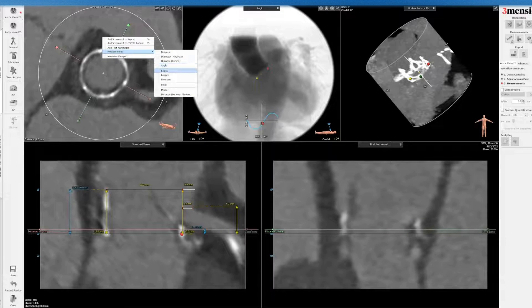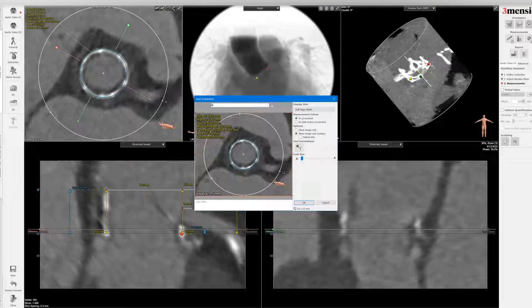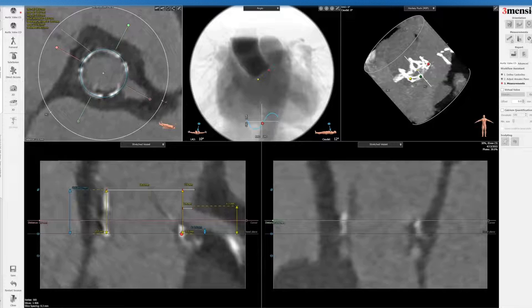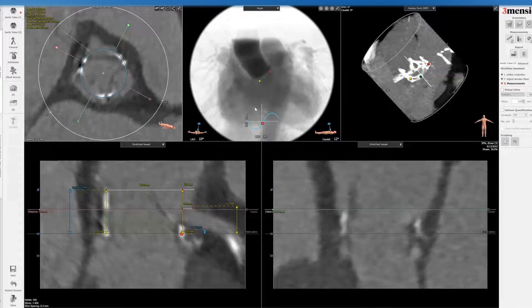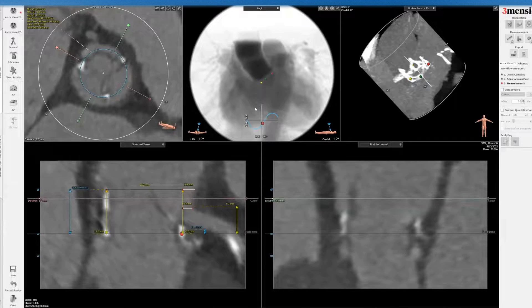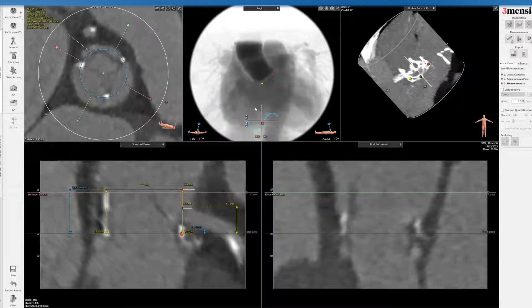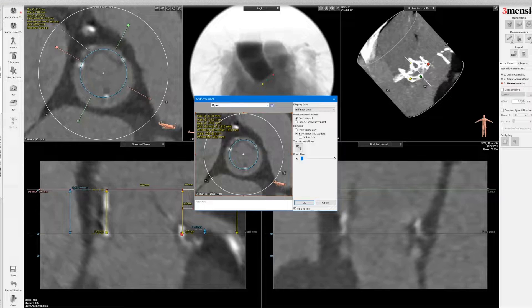You can see this is the frame. I'm going to draw an 18 millimeter ellipse — in between the 17 millimeter inner diameter and the 20 millimeter maximally expanded size — to show how it fits right to the root anatomy. One thing I've learned with valve-in-valve workup is that if your end-systole imaging is suboptimal in quality, you can use the end-diastole imaging, because then you can actually see the leaflet quite well. And you can see that here — that's also an option.